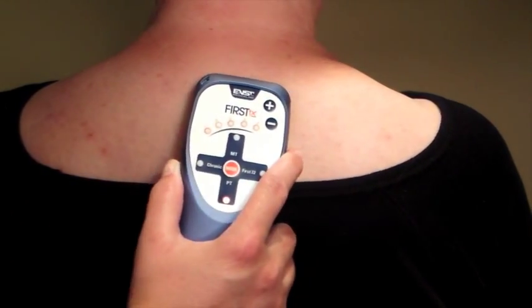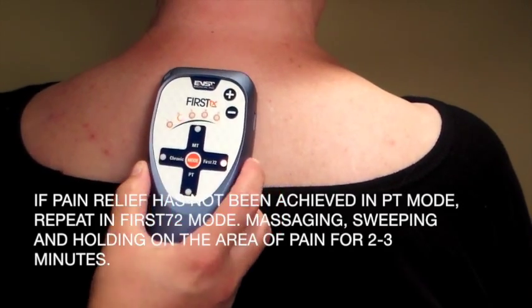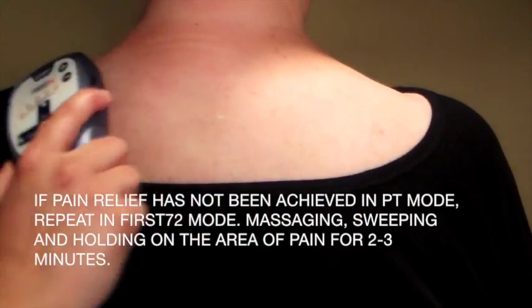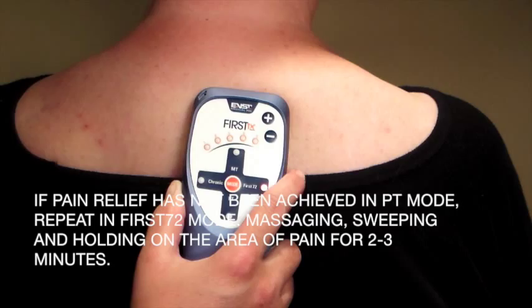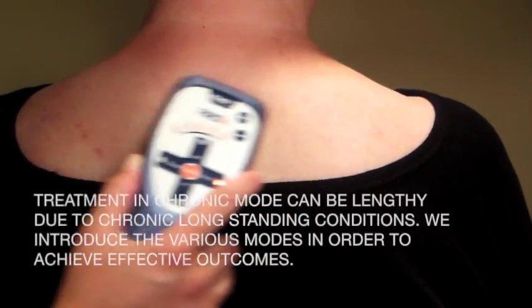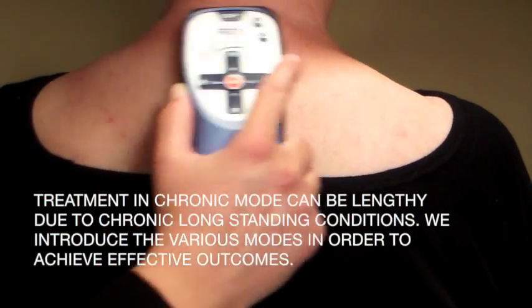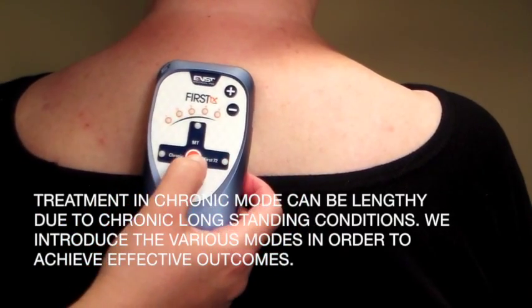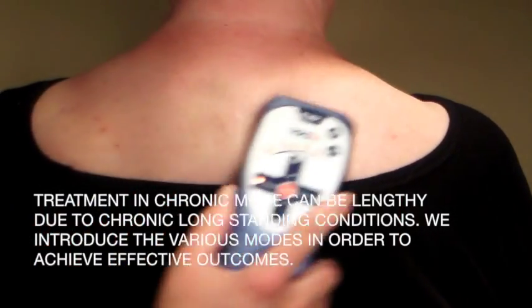If after attempting MT mode relief has not been achieved, we're going to try PT mode and return to sweeping and massaging as well as stopping and holding on the area of pain. If pain relief has not been achieved with this, we can also introduce the First 72 mode using the same technique: massaging, sweeping, or stopping and holding. So treatment in the chronic mode can be more lengthy than the others, and we introduce the various modes to get results.